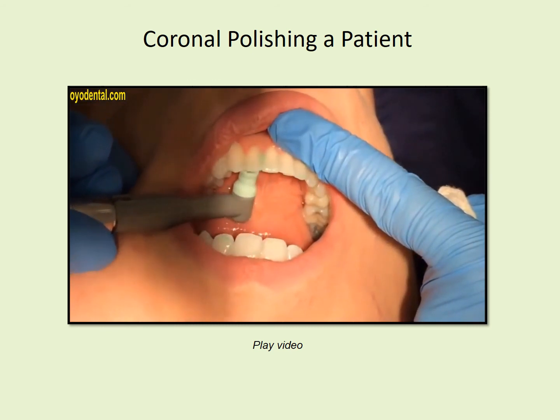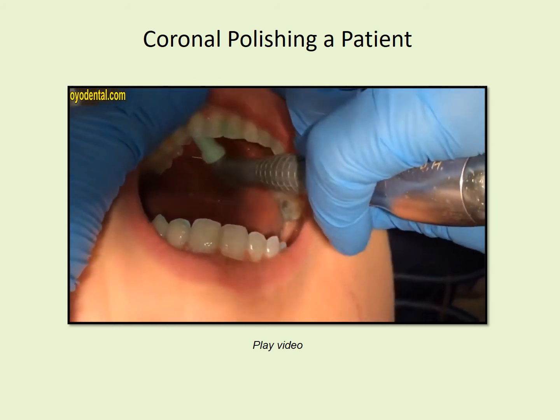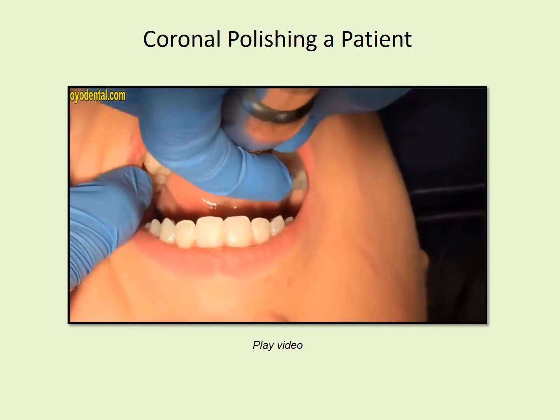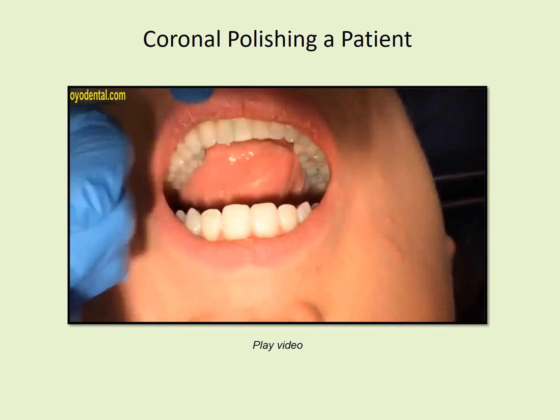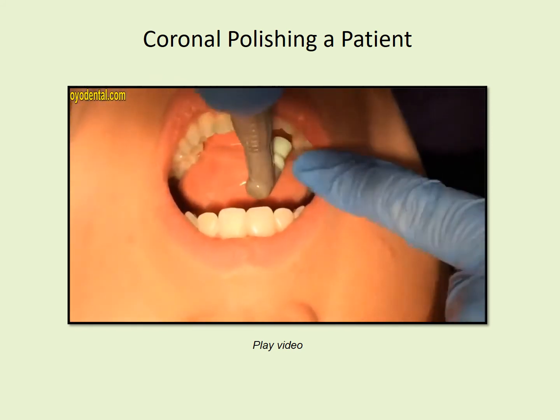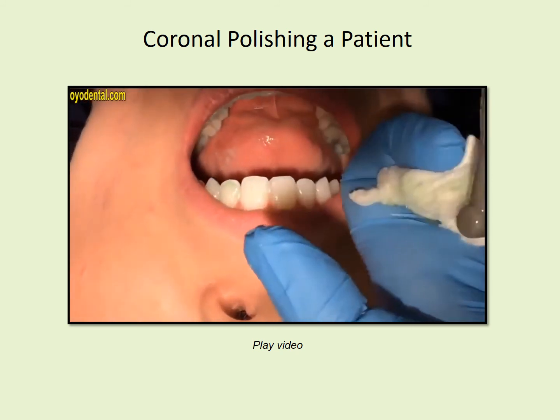When polishing, I feel like if you do a really good job with your scaling, you don't have to do a ton of marginal polishing as you remove that biofilm with your instruments. Don't forget the occlusals. They don't get any action with the instruments.